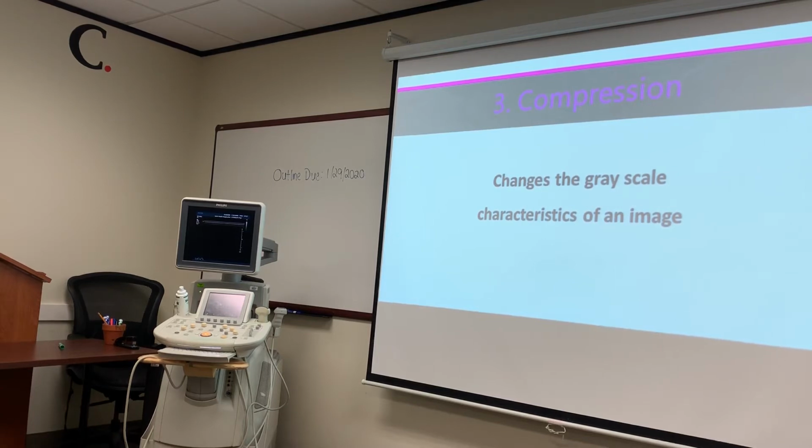Okay. So number 1 says you are using a 4 megahertz transducer and have adjusted the TGC perfectly, as represented by the red TGC line. That's the middle one, guys. That's the solid line up there. You are given a new transducer with an unknown frequency. The TGC is then adjusted to create the same image that is obtained using a 4 megahertz transducer. This new TGC setting is the purple dotted line. Is the frequency of the new transducer greater than or less than the 4 megahertz transducer, and why?